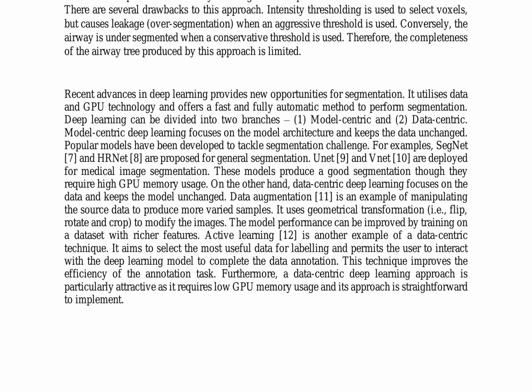The data-centric approach has shown promise in improving airway segmentation, enabling the creation of accurate 3D airway tree geometries. This, in turn, facilitates objective quantitative assessment of airway damage and disease severity in IPF patients. Further research is needed to fully explore the potential of deep learning in airway segmentation and its application in IPF diagnosis.